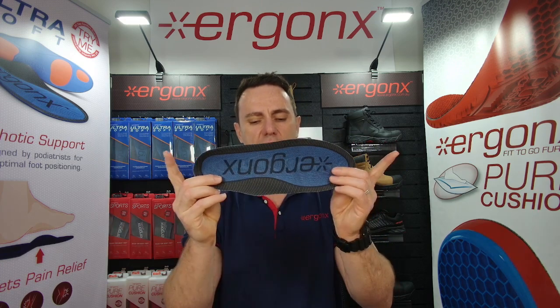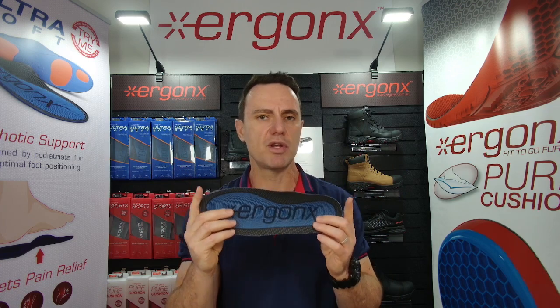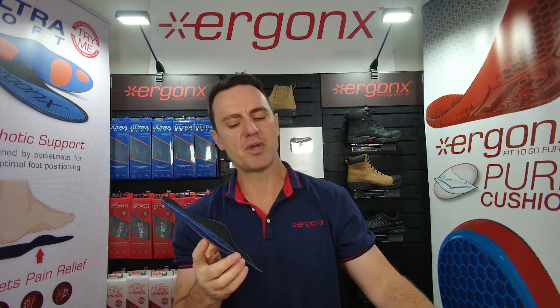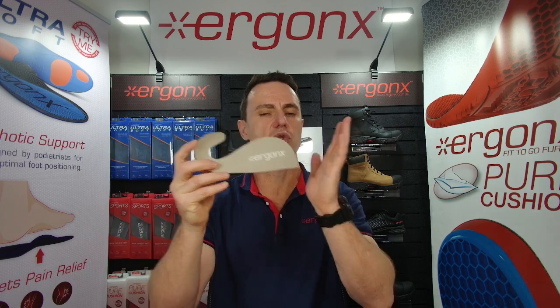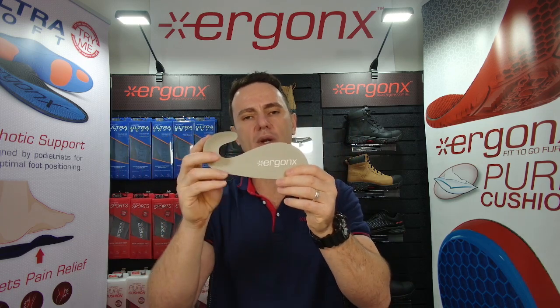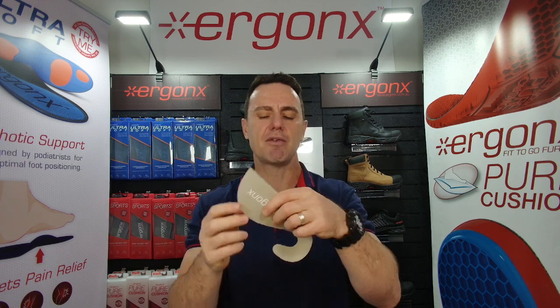We usually opt for the full-length insole. As a general rule of thumb, the biggest insole that you can fit in your shoe is usually more supportive and more cushioned than a smaller one. But if you can't fit anything else in your shoes, or you need to wear certain fashion shoes to meetings, the Ergonix Slimline will still help support your feet — it just lacks some of the cushioning, but it's better than no support at all.